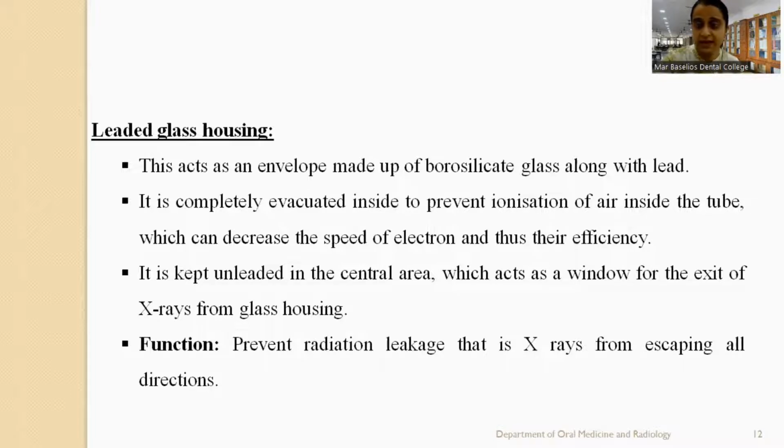What happens when there is ionization of air inside the tube? It will decrease the speed of electrons, and as a result, the efficiency of the machine will be reduced.